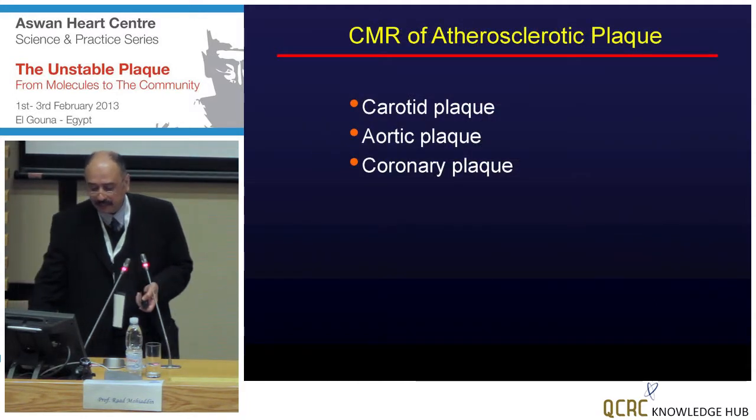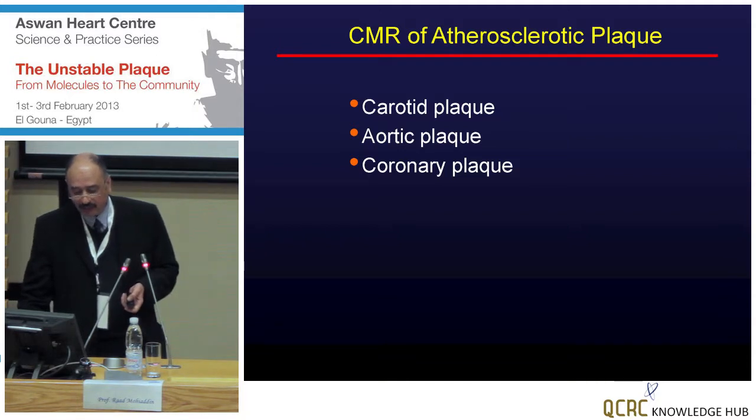When you come to the MRI technique, it's been very useful for looking at the carotid plaque, and there are some studies on the aortic plaque, and very limited studies on the coronary arteries, because this is a problematic area, and I will allude to that during the course of the lecture.